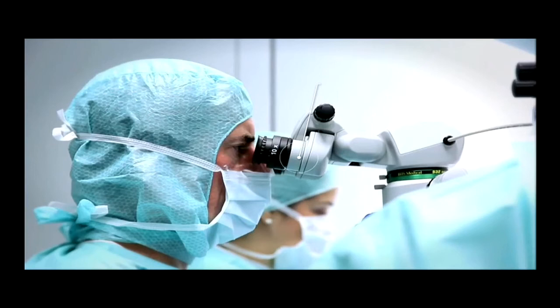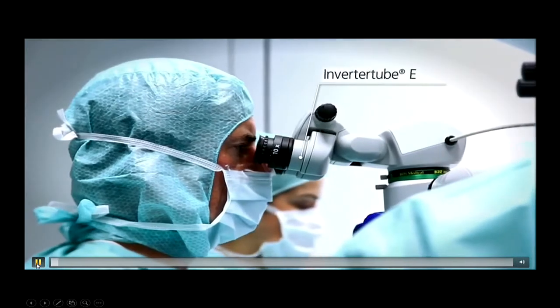As the microscope moves up, the field reduces. As you go closer to the cornea, the field increases. And the ideal distance should be around 8 millimeters approximately between the cornea and the lens to get the correct focused image. As far as ReSight is concerned, the focusing mechanism is slightly different.